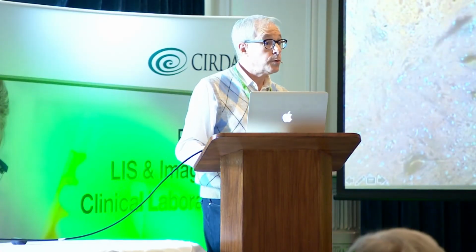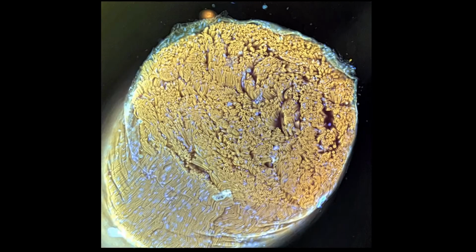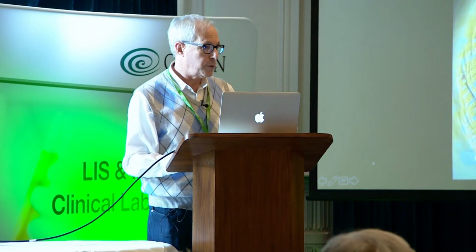It's nice for toxicology, so we're starting a study to look at neurotoxicology, chemotherapy, and nerve damage. This is an unfortunate rat's sciatic nerve, and you can see the individual myelin sheaths. Also, what's nice is that you can see the actual surface of the sheath outside the nerve, this very, very fine layer of cells surrounding it that would be almost impossible to capture with conventional histology.